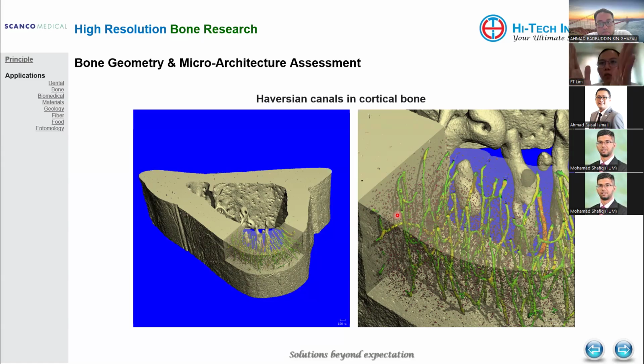So the software will highlight and contour all these features that fall within the density range, and you get this beautiful layout.